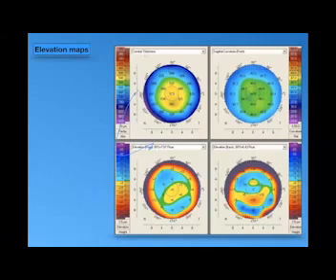What if I have a patient with a regular bow tie and I don't have any inferior-superior asymmetry, but I just have a steep cornea with a K reading of more than 48? Do you go for any type of ablation, like surface ablation, or will you hold off ablating this patient? You mean that we have a steep point, but superior or inferior? Steep bow tie. I have a point of 40 in the upper part. Yes, but no inferior-superior asymmetry, just a steep bow tie in a patient with high astigmatism.